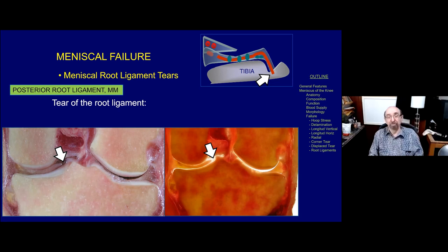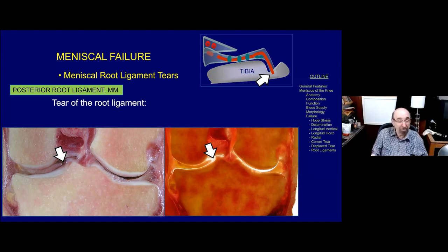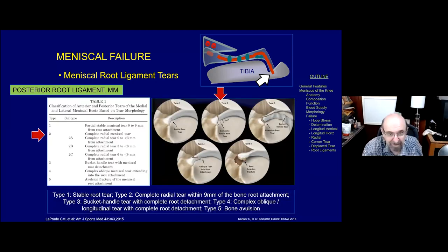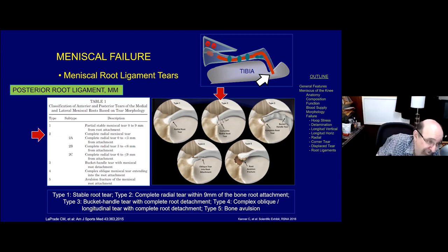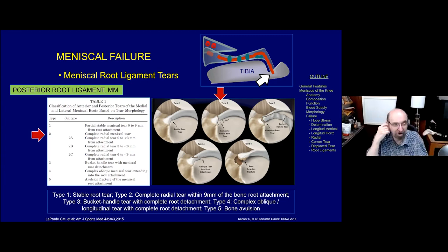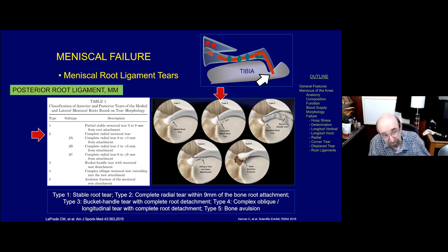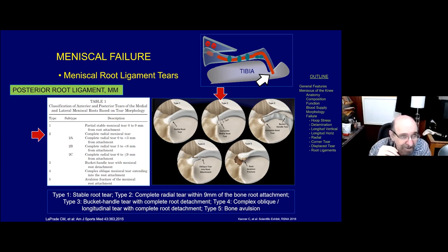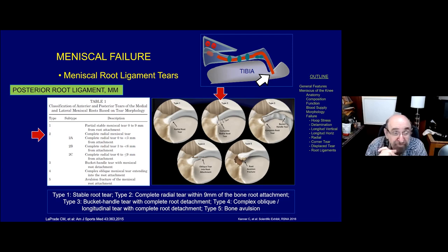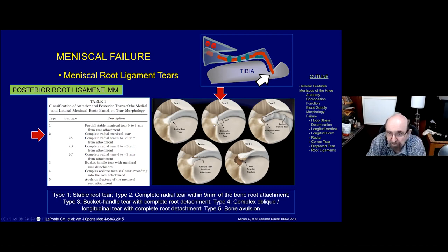A full thickness tear of the posterior root ligament of the medial meniscus ends abruptly - there is a gap, much like the radial tear shown earlier. The LaPrade classification has five types; the one I see most commonly is Type 2, a complete or near complete tear of the posterior root ligament, further divided into 2A, 2B, and 2C depending upon how far the tear is from the footprint. In 2A the failure is close to the root ligament; as you get further away in 2B and 2C, the gap becomes more prominent. The further from the footprint, the smoother the end of the posterior horn; when the root ligament itself is involved, you have a shaggy, irregular end.